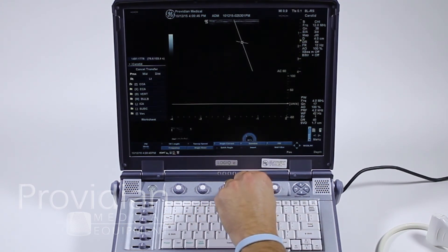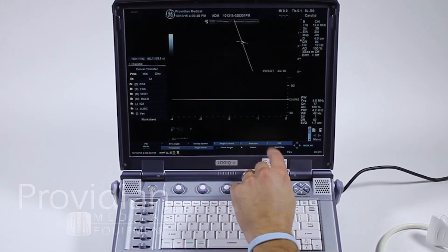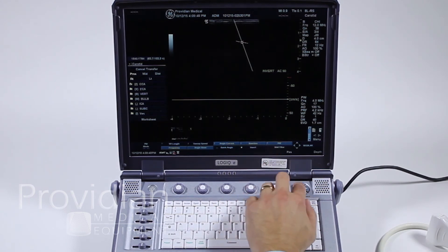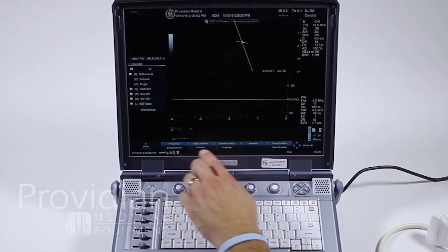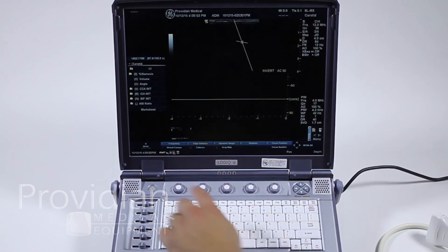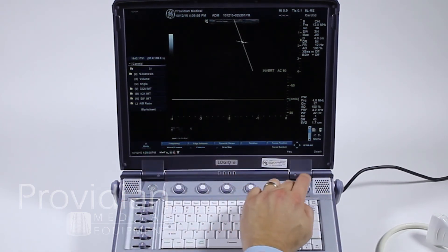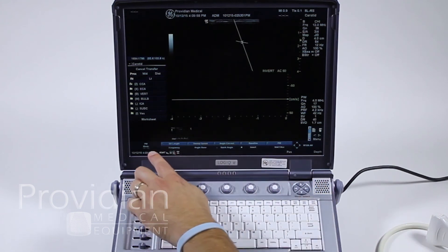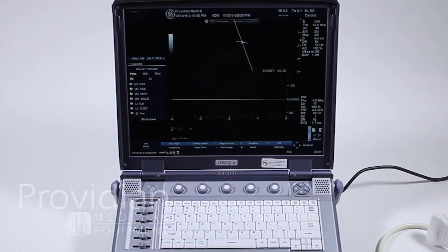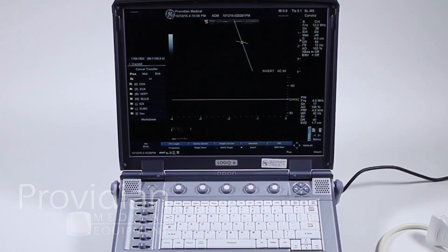Adjust your baseline. You can click to invert. Pulse repetition frequency, your wall filter, and then these are all B mode imaging settings. You'll see here it says B mode — if I click to the left, it says PW mode. So that's going to tell you exactly what parameters you can adjust and what the active parameters are.